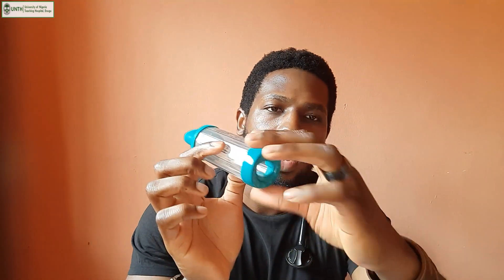For some people it might be difficult to go through the breathing techniques described while using the pressurized metered dose inhaler, and that's where this device comes in. This is the spacer aerochamber, which consists of three main parts: the mouthpiece where you place your mouth, the glass aerochamber where the medication will be, and the opening where you connect your pressurized metered dose inhaler.